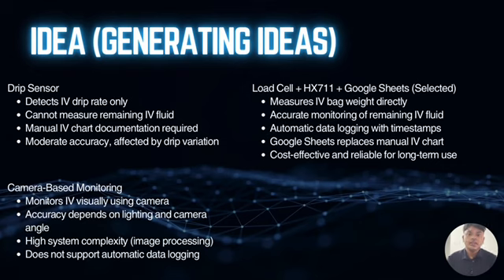In the idea generation phase, various IV monitoring techniques were assessed, including a drip sensor and camera-based monitoring. But these two approaches can detect IV flow, but they lack accurate fluid quantification and automated documentation. As a result, we chose a smart IV monitoring system employing a load cell and an HX711 amplifier. The IV bag weight is processed by an ESP32 and automatically logged into a Google Sheet with a timestamp, enabling real-time monitoring and digital record keeping while reducing human error in manual IV charting.